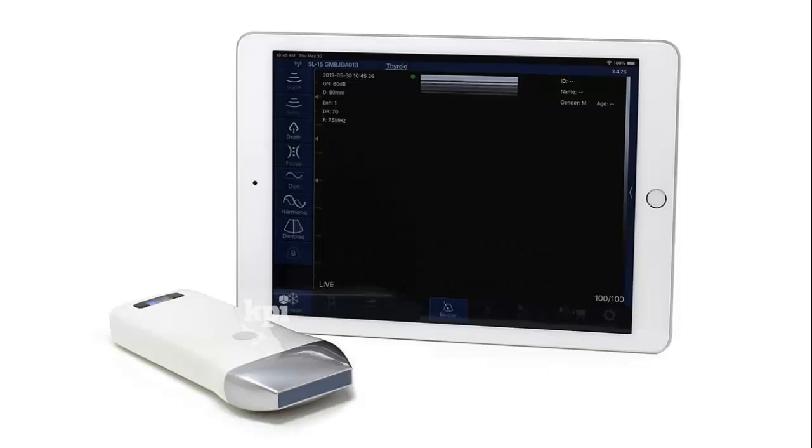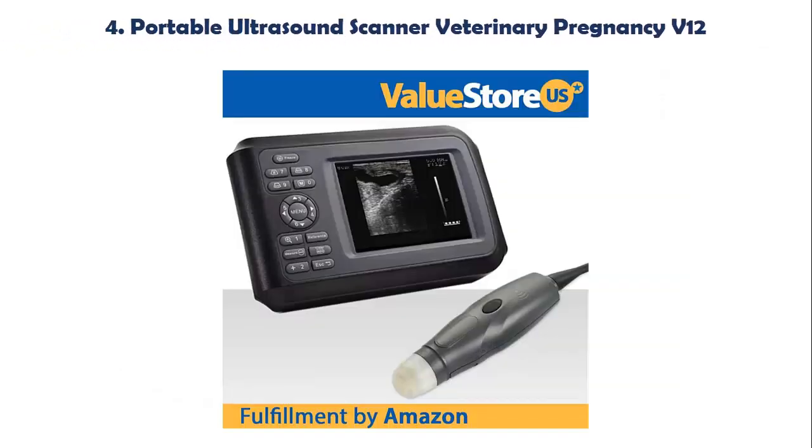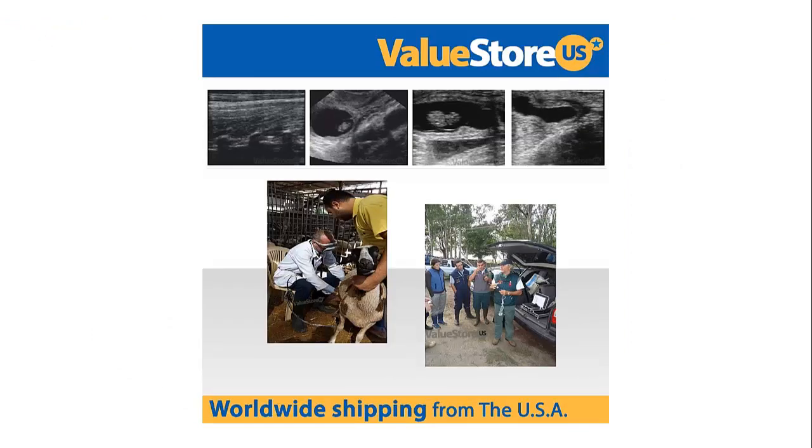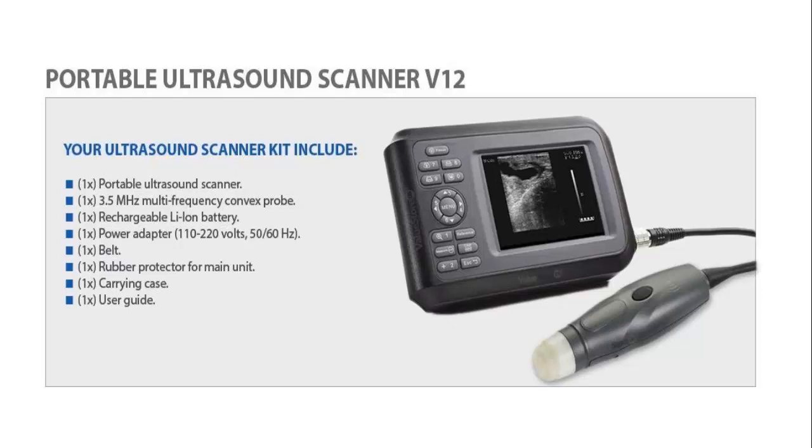FDA Approved, CE Certified Medical Device. Our list at Number 4: Portable Ultrasound Scanner Veterinary Pregnancy V12. Its rechargeable battery makes it convenient to carry. A silicone case with belt allows indoor-outdoor use, protecting it from falling during a diagnosis with an unexpected move. Multi-color display and AV port to view real-time images on your TV or monitor of up to 42 inches, or to connect a video printer.